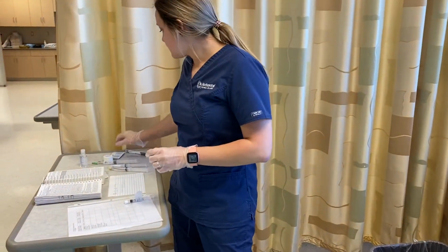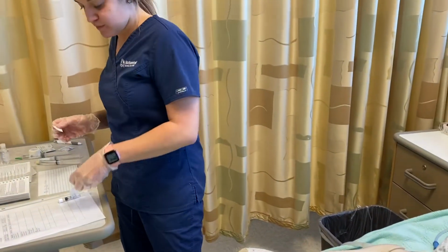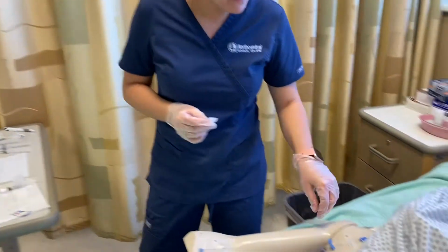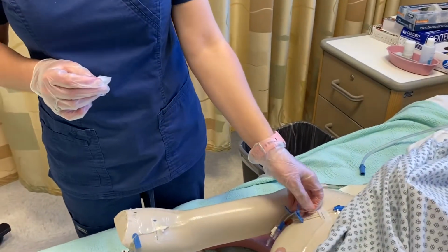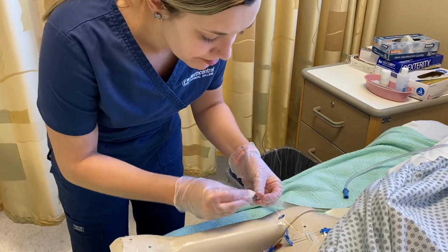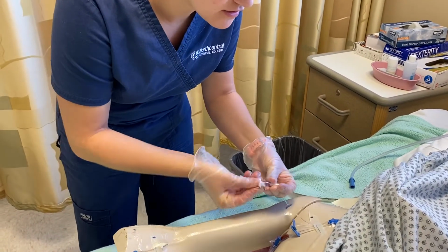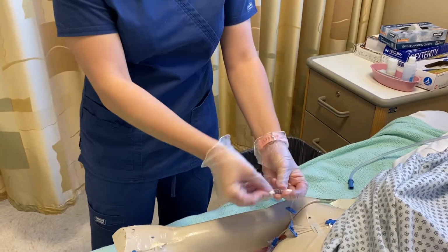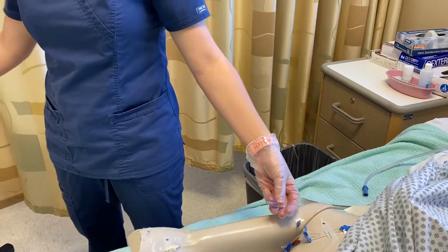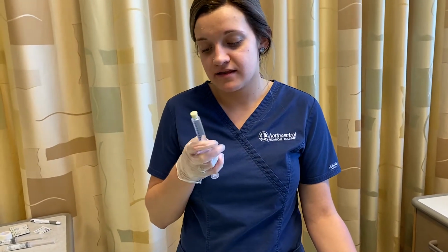Okay, so the first thing I'm going to want to do is clean my ports. I can choose any of these ports that aren't a TPN line, so we're going to go with this one. I'm going to clean for the right amount of time, usually 30 seconds. I'm going to let that dry. I already checked the expiration dates on my saline, and they are not expired.